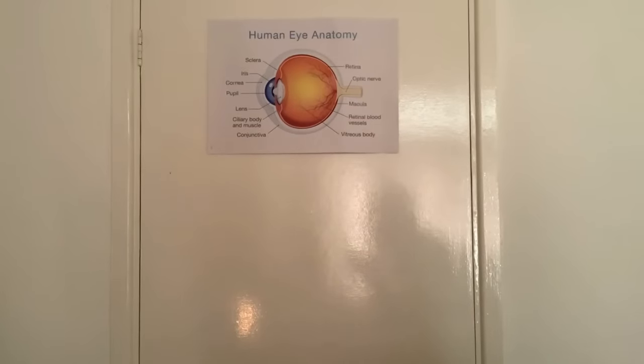Okay, so just looking at your left ear in general. Okay, now the otoscope's going to go into the ear canal. Excellent, just gently. And again, there doesn't seem to be too much of an accumulation of wax. I can't see any scarring, discharge or redness, so there's no inflammation. Not having any problems with your hearing. So that looks great. Excellent, thank you.